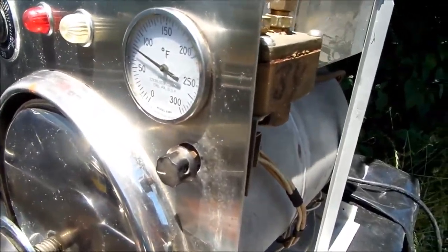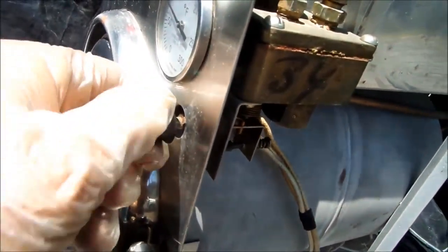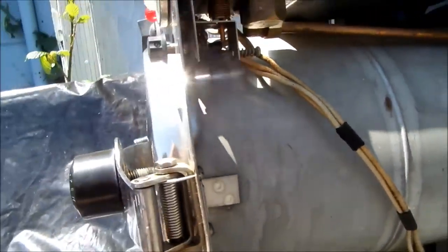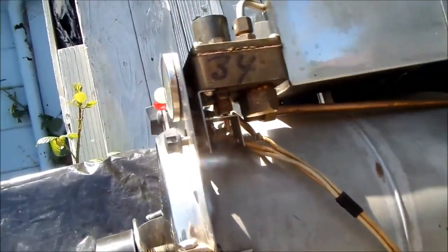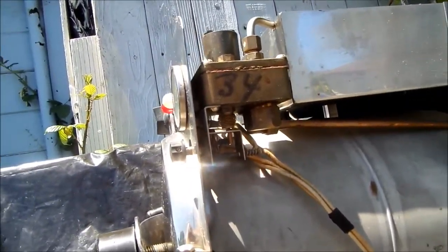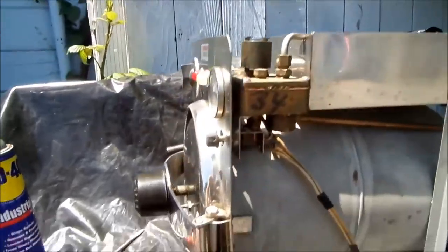The next thing we're going to check is the pressure switch. There are two contacts in there — the points. We need to make sure that they're making contact when the switch is closed.